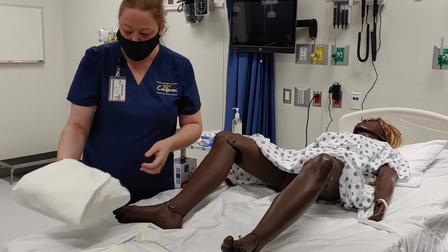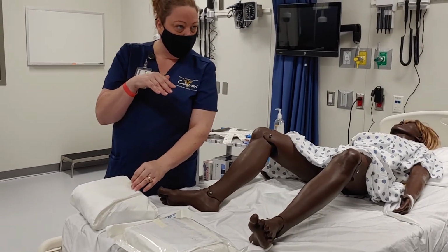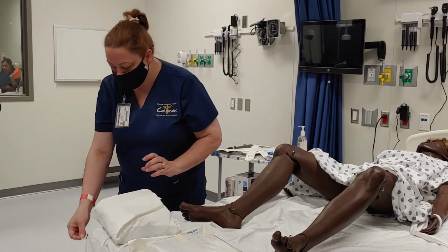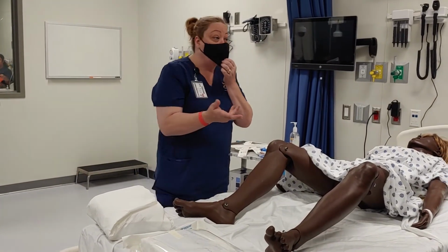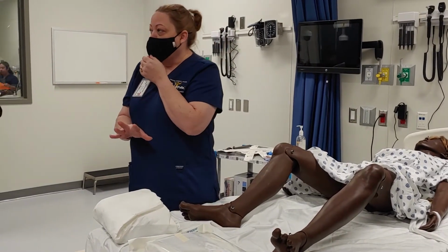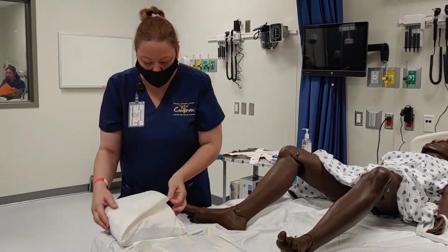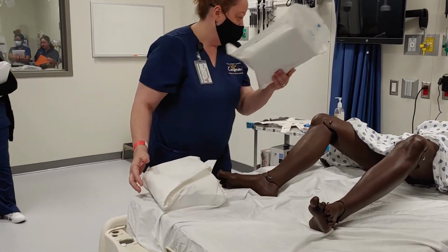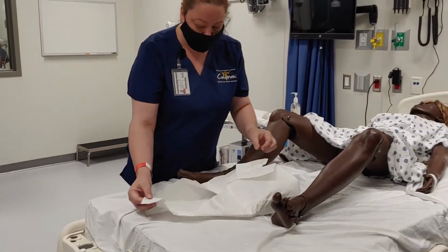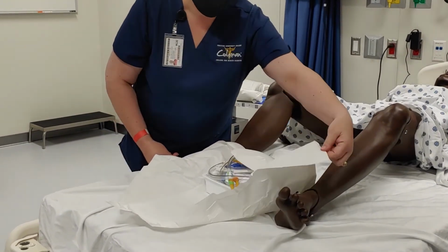Now, typically when you're doing this on people, especially in the office, they are coherent, okay? So they can kind of help you out. Most people are going to be ambulatory, meaning they're able to move on their own, all right? So when we do certain parts of this, I have to have the patient move into a different position. So for this part, I'm just going to go ahead and open it up. I would set it up here close to where I'm going to be working. I'm opening this up. Now this kit is sterile.